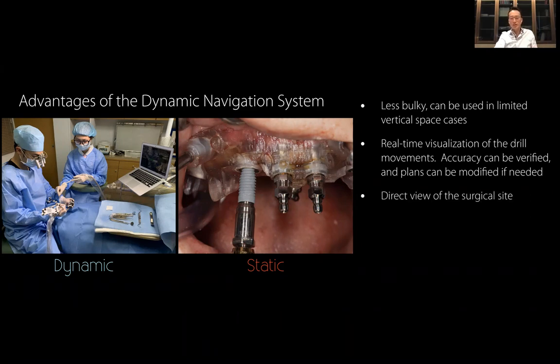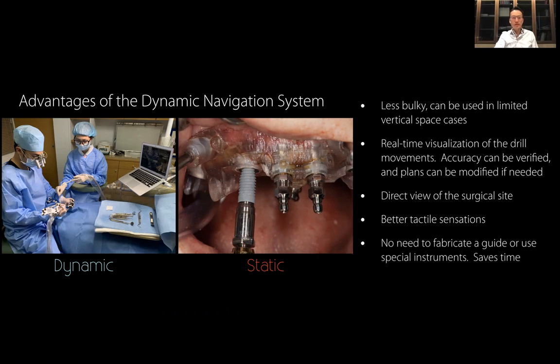Okay, so we can see the surgical field very well. And then the drilling is just like a regular drilling process. So the tactile sensation is immediate and it's very good. And then we actually save a little bit of time because we don't need to wait for the surgical guide to be made. So if we're really doing this in a hurry, I can actually save some time.